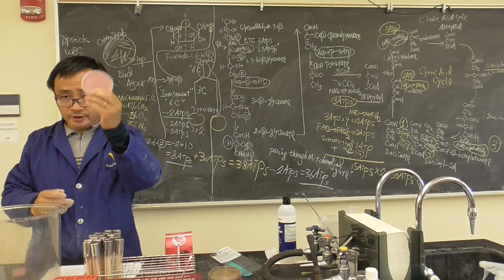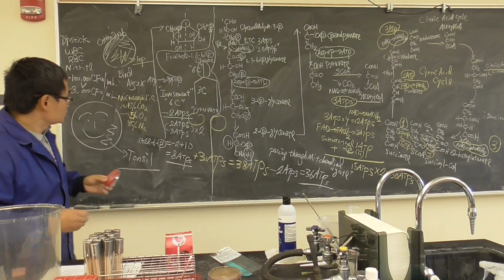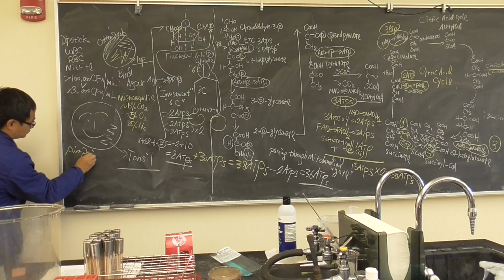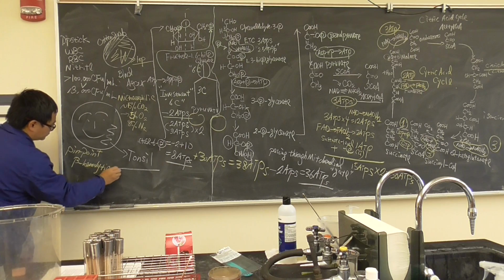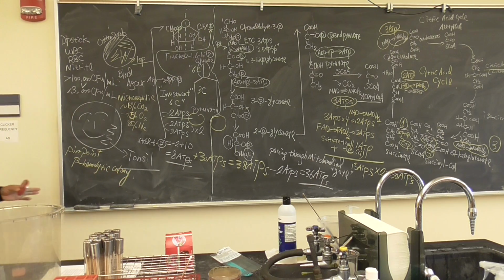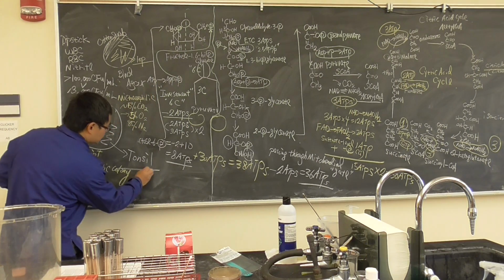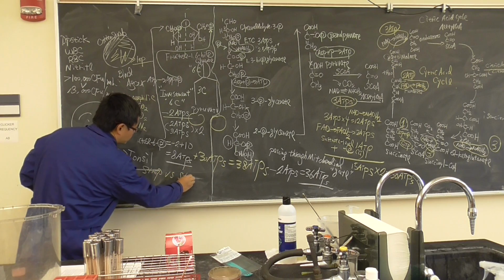We will look at the plates, look for the pinpoint beta hemolytic colony. That is important. Pinpoint beta hemolytic colony. Because the pinpoint beta hemolytic colony could be streptococcus, it could be staphylococcus.